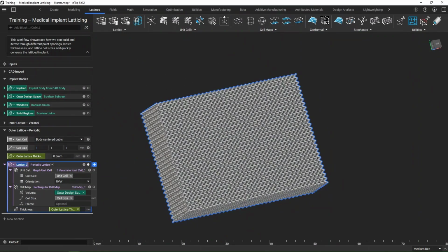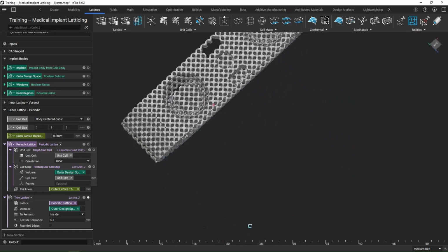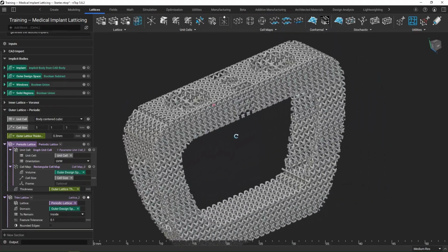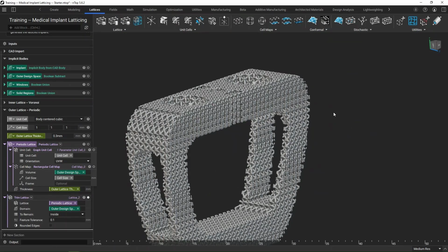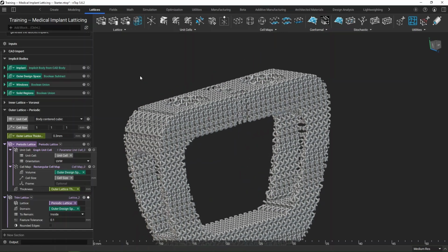I'm going to go ahead and make this a variable nonetheless. We can go ahead and call this our periodic lattice. And then again, we're going to do a trimming operation. So I've got my trim lattice. We can drag the periodic lattice into here. Our domain is going to be that same outer design space. We're keeping our lattice inside. That tolerance of 0.1 works for us. And I can click on this, hit isolate, and then we can see how it's filling up the volume from there. And so we can really play around with a lot of different lattice types. Maybe how it's trimming at the beams is something of interest to play around with. But we do have it joining back on with that solid region. So some of that behavior is certainly something to consider.